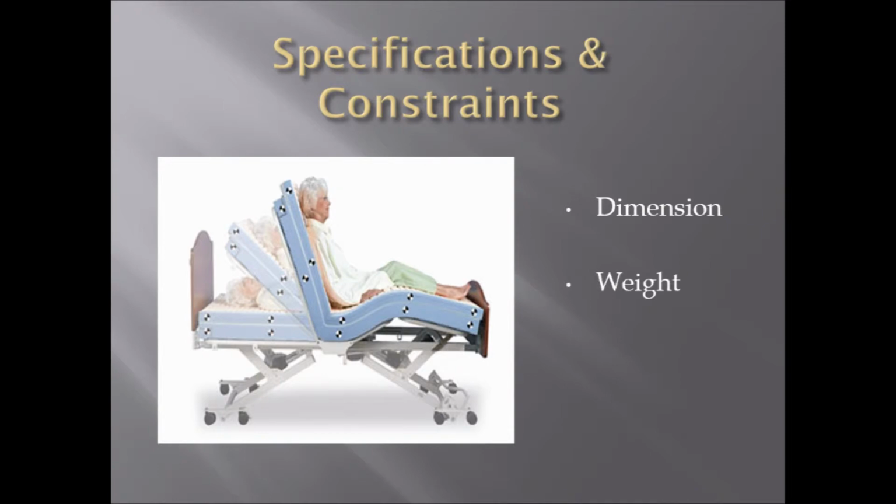The older model hospital bed has 203 cm of length, 90 cm of width, and 60 cm of height. It has a headboard and footboard of square tube, a mattress platform structure of steel, and a steel strip mattress platform articulated in two sections. It has an adjustable headrest through the rack, fitted with a protection pad, and it weighs around 150 kg.